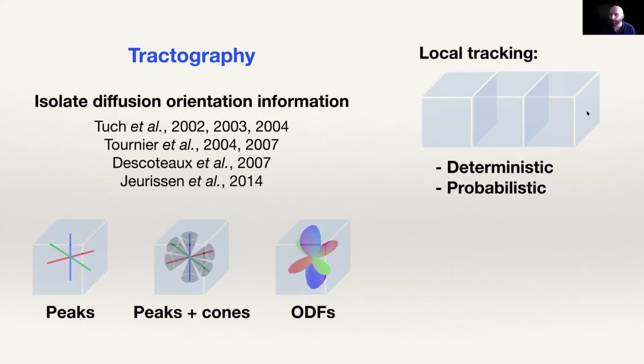fiber-ish streamline. So for example, that would be this one. And for a deterministic algorithm, this is the only one you can ever get. And that's it, because it is deterministic. Once you're on one path, you will not change it. You cannot go some other path.